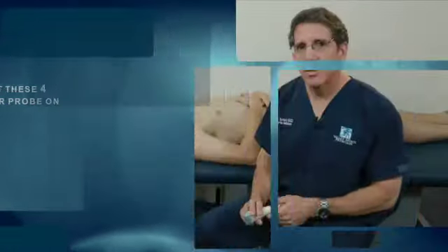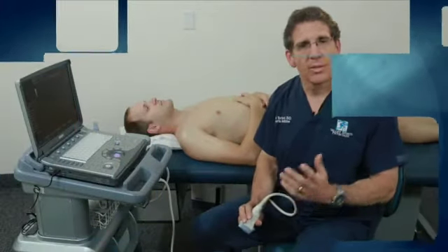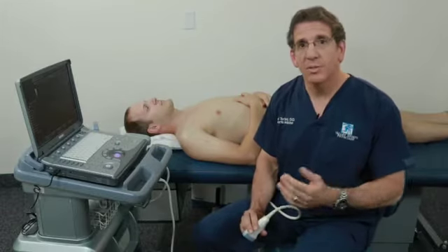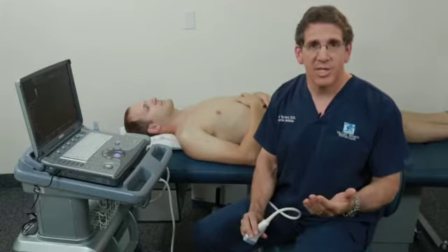Before you even set the probe down on the patient, think about the structure that you're going to be scanning. Is it going to be shallow? Is it going to be deep? Do you have a heavy-set patient or a lean patient? Try to set your machine settings so that you minimize going back and forth from the patient to the machine to adjust those settings constantly.